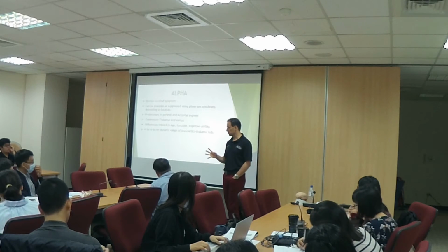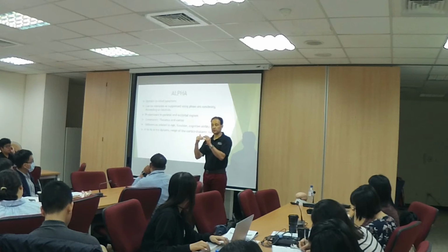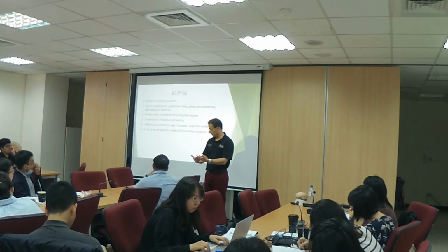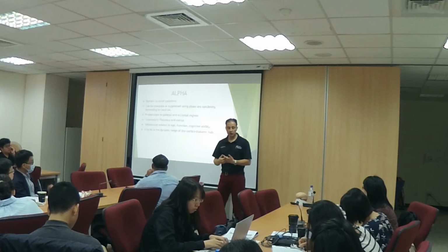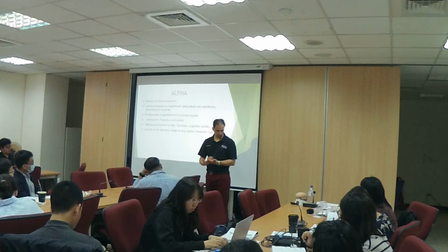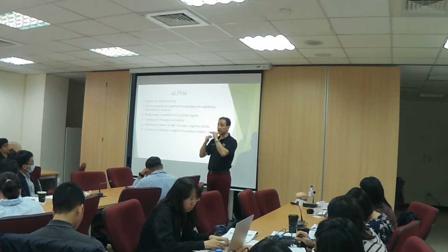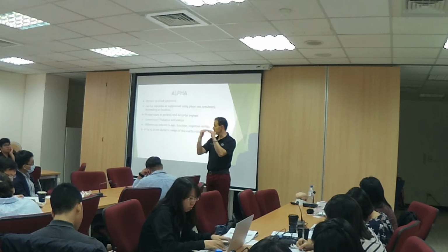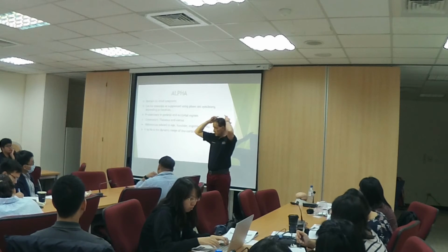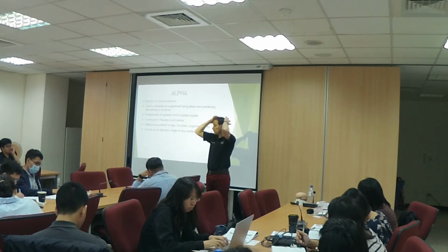So IQ assessment. Now the peak alpha frequency is not going to tell you what the child's or the person's IQ is. You need to test it, but it's a good predictor of that. And it's called a brain brightening protocol or brain boosting protocol. So you can train C4 and PZ. If you want to increase IQ, if you want to help with intelligence, if you want to train learning disabilities, C4 to PZ. That's your intelligence and your IQ up.